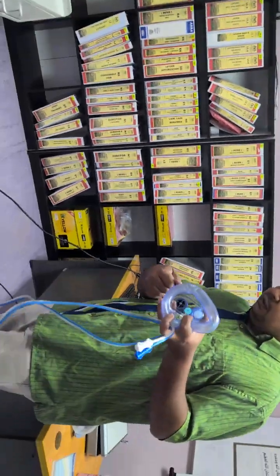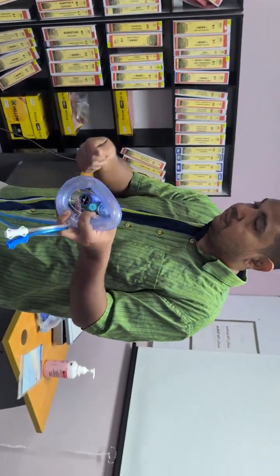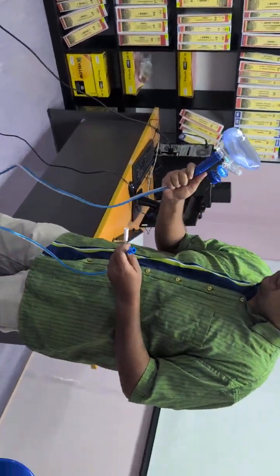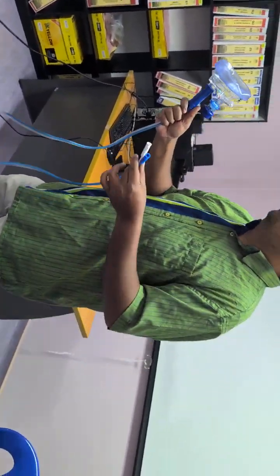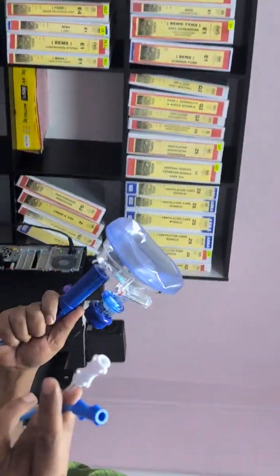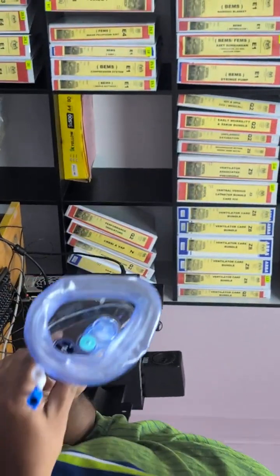They will give you all the calculations here, which I'll pass around. You guys can have a look. Let's say the patient requires PEEP in the ambulance itself. You just pass on this. That is why the pre-hospital care guys are already giving this.